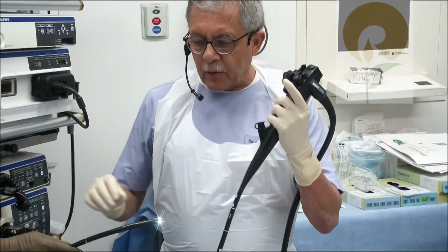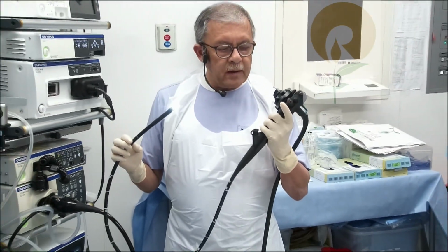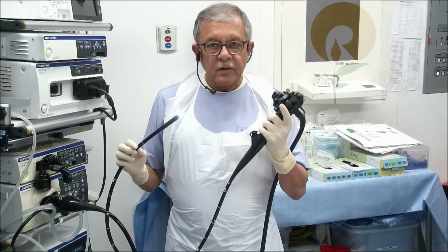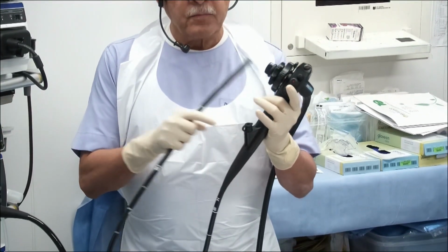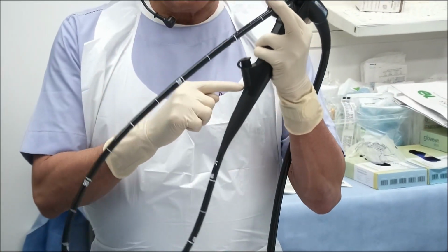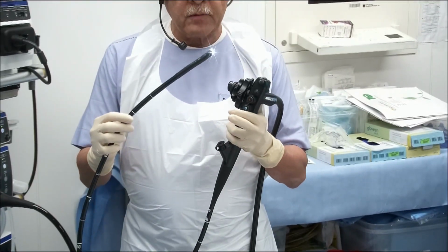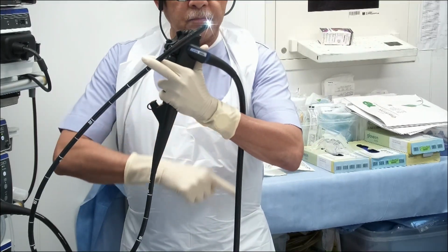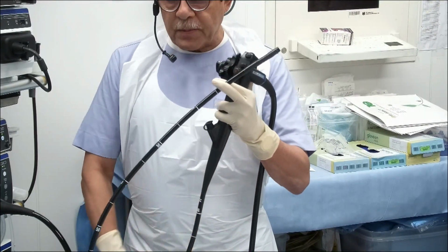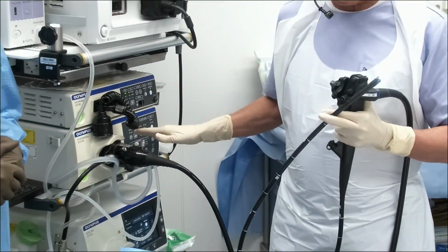So, now if you can see here, this is how an upper GI endoscope looks, and what I am holding in my hand on the left side is called the control section. Then this tube, coming out from the control section going ahead, is called the insertion tube, and this over here is the connecting tube. The connecting tube goes behind and gets attached to the endoscopy processor and light source.